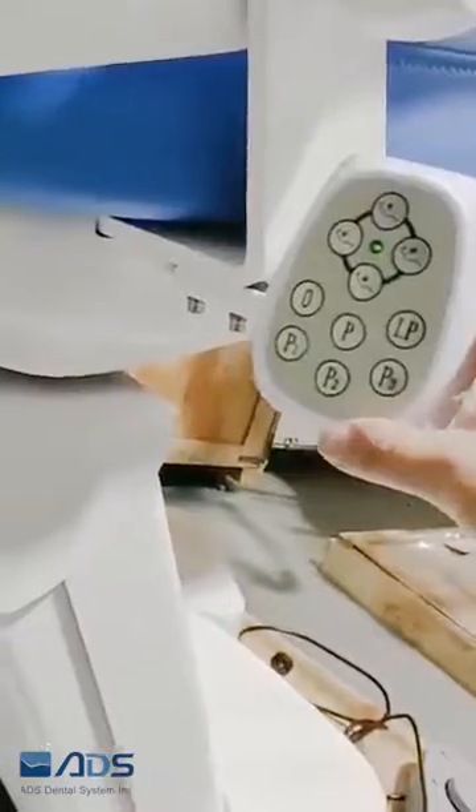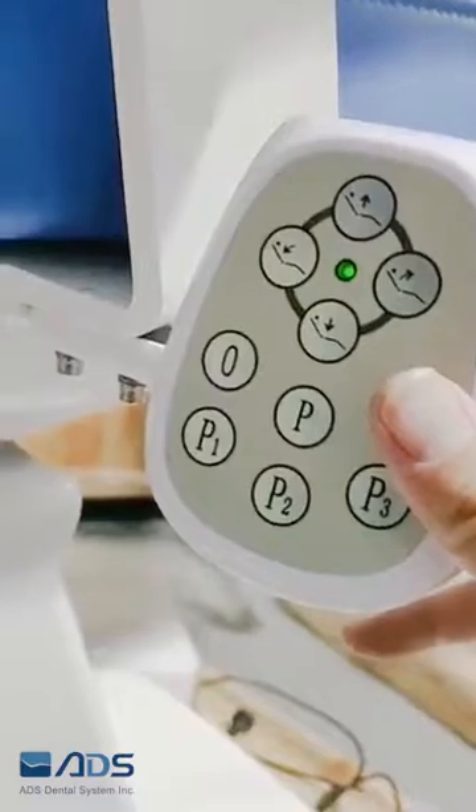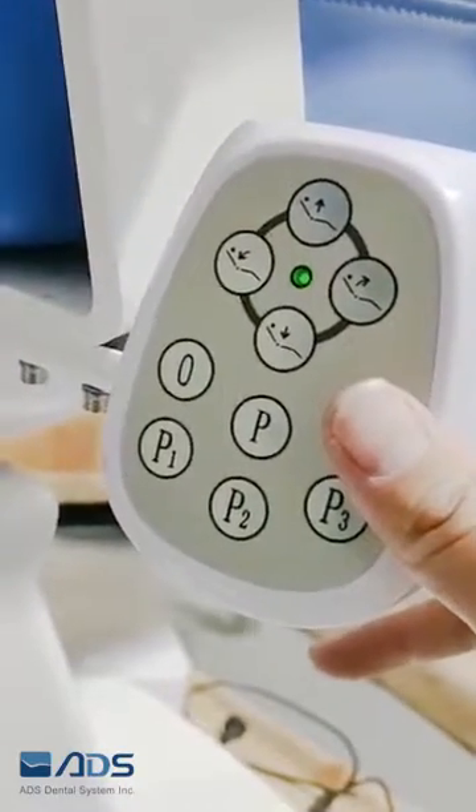Then press the LP button. You will hear two beeps, and then you have finished all the settings.